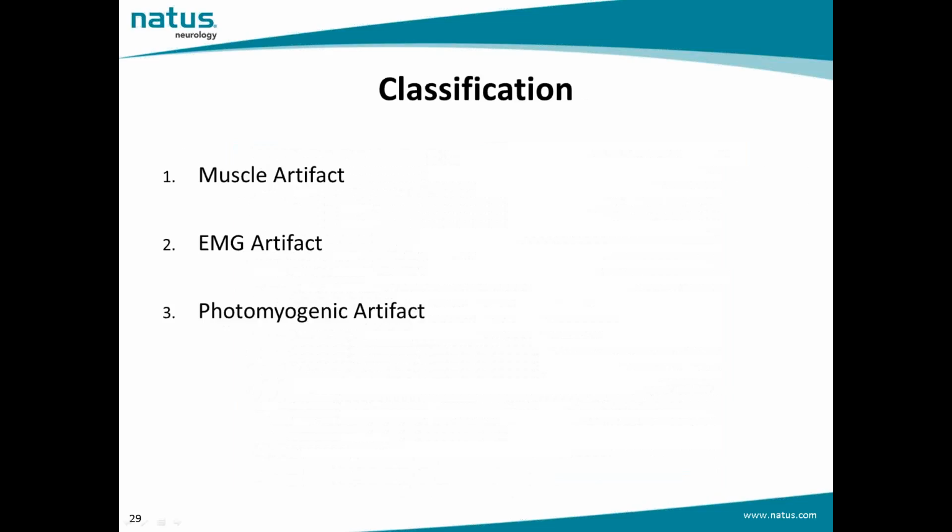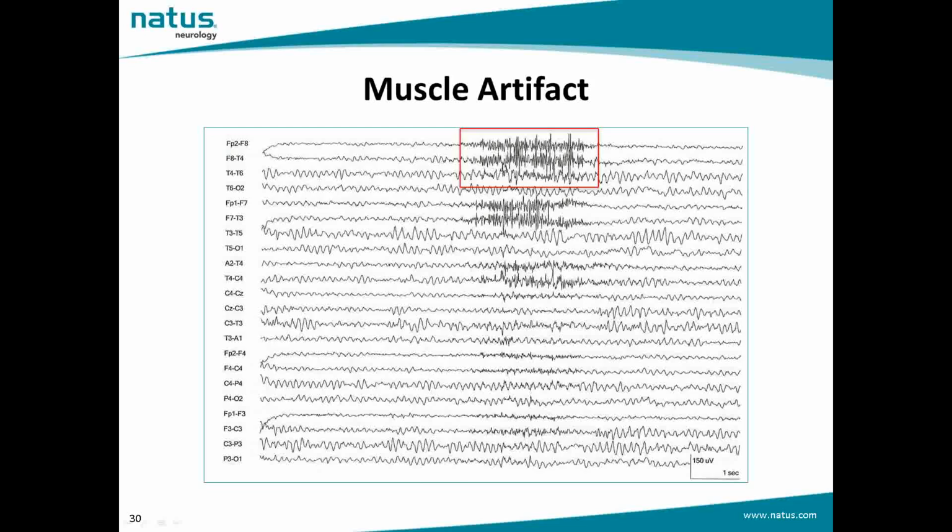In this picture, in the rectangular square, we have a typical example of muscle artifact. Sometimes it's not easy to distinguish the muscle artifact from beta activity or epileptiform spikes. Reducing the settings of the high frequency filter will reduce the amplitude of these spiky potentials, but will also change their form so that single muscle potentials may look more like abnormal epileptiform spikes, and repetitive potentials may look like cerebral alpha or beta activity.